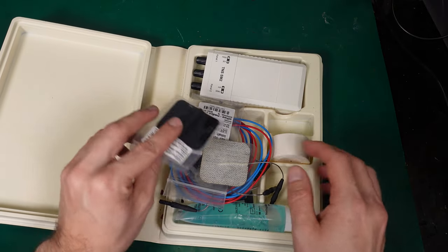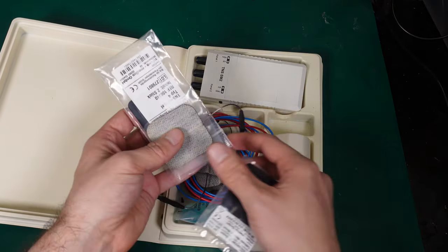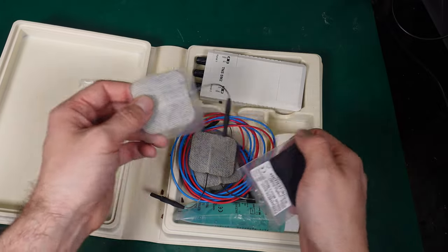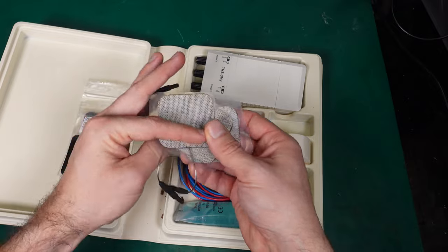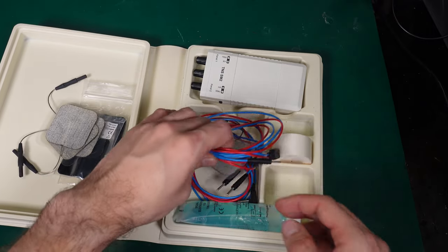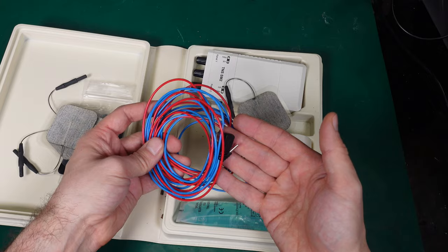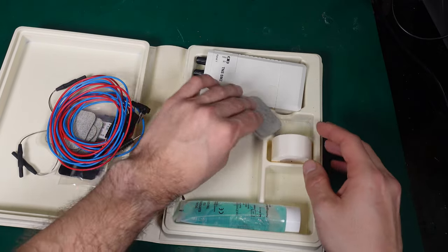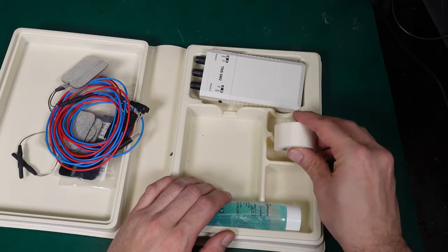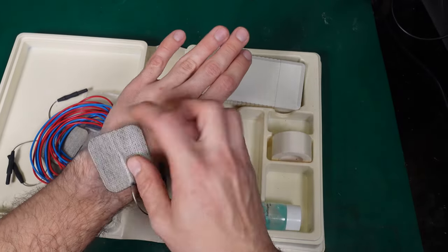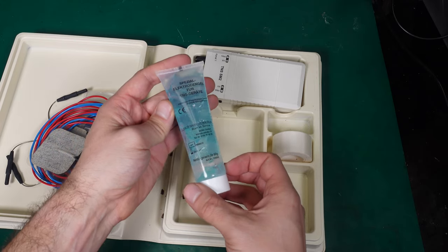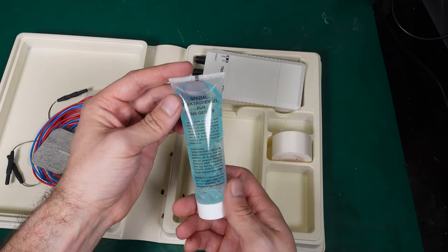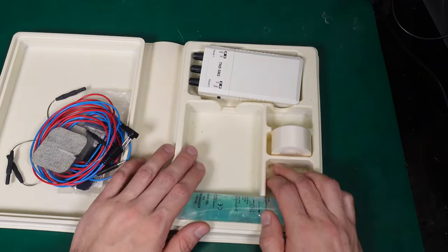This is how the device looks like. So we've got a bunch of electrodes that you are going to attach to your body, you've got wires to connect them together, we've got tape to put the electrodes in place and prevent them from moving, and we also got some sort of gel.